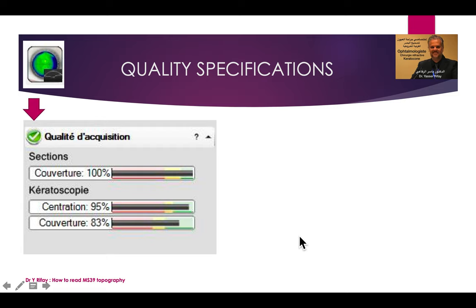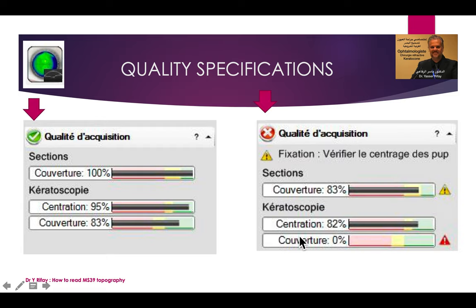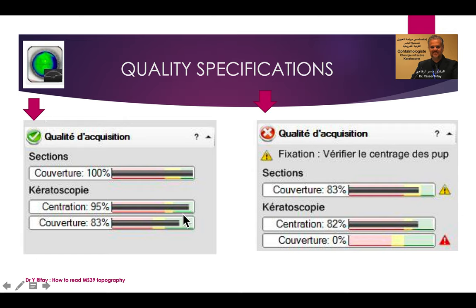We should start by quality specification. We cannot use or read captures or maps if the quality is bad. In this case the quality is bad — the coverage quality of the keratoscope is very low — so we cannot use these maps and we have to recapture. In a good case, the coverage is green for sections, centration of keratoscopy, and coverage of keratoscopy.